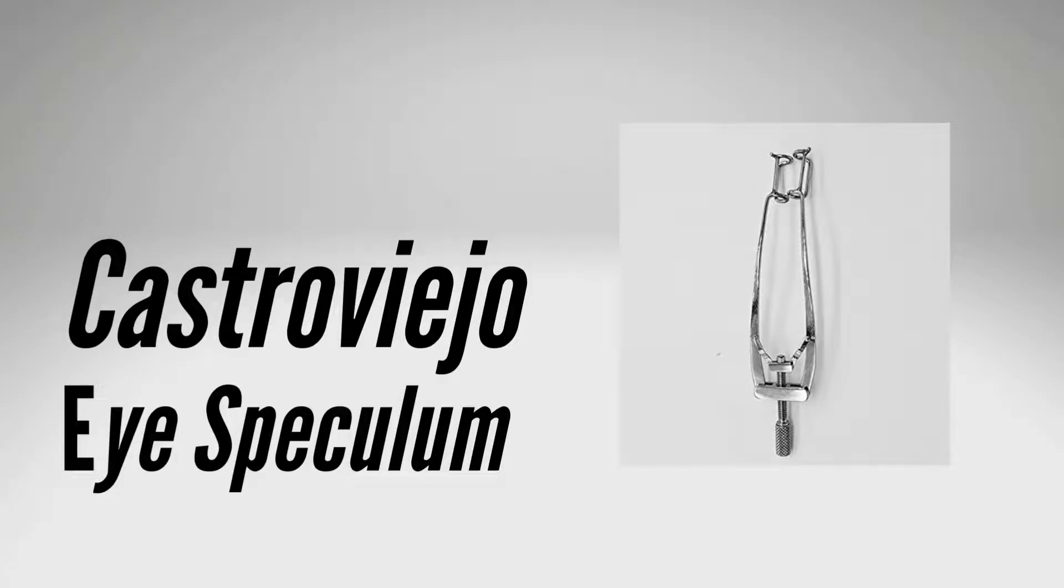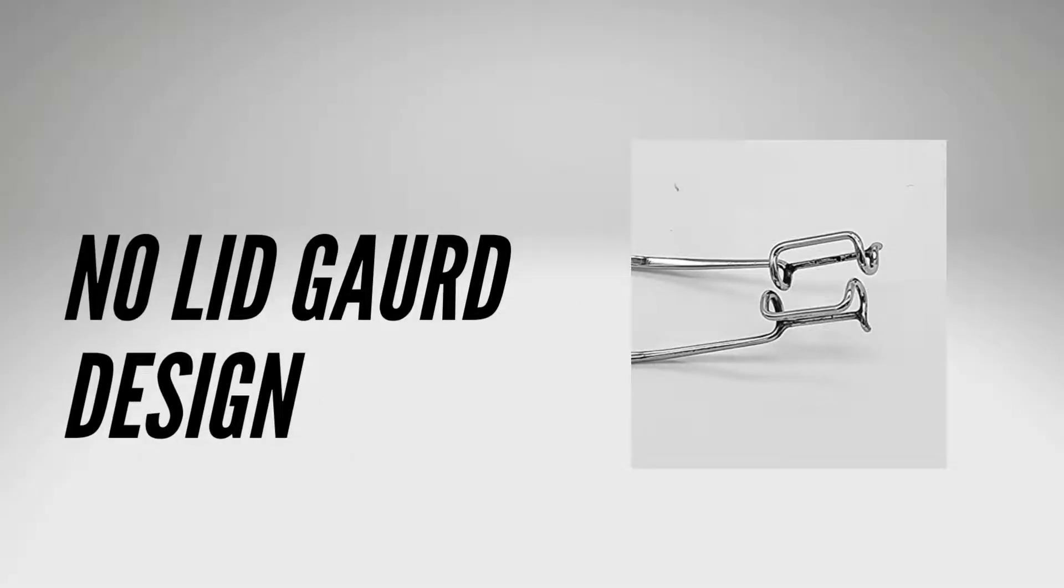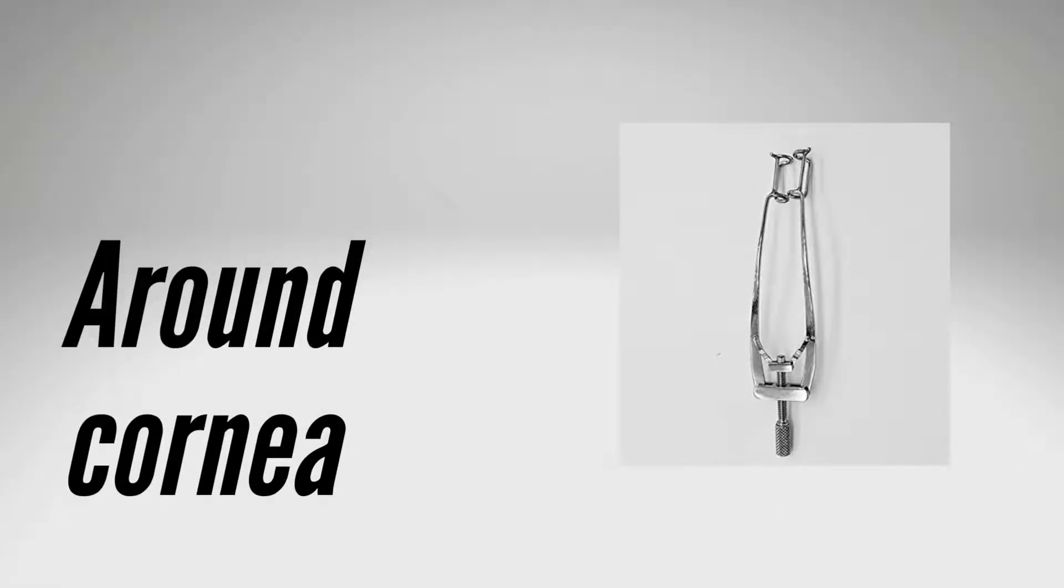The Castroviejo eye speculum is a lightweight design used in various ophthalmological surgeries, commonly for surgical procedures on and around the cornea.